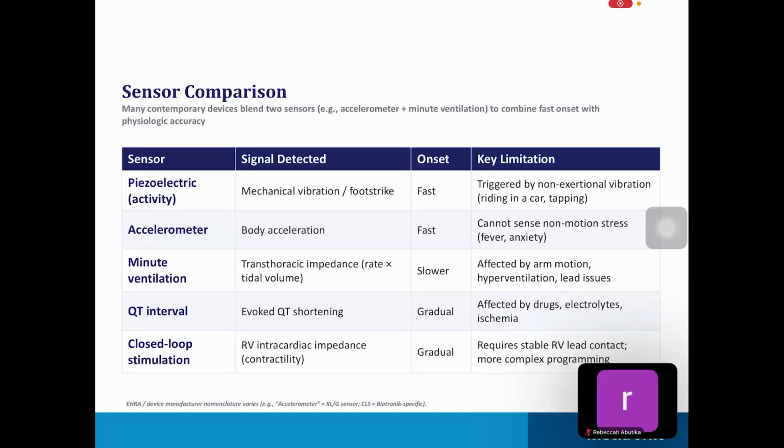But the R in the NBG code, if the patient has DDDR mode, and the patient has no intrinsic activity and moves, the heart rate will increase according to his activity to reach 100, and when he stops his activity, the rate goes slower to reach the lower rate limit again. This is the R, the fourth letter in the NBG code, mimicking the intrinsic activity of the heart.